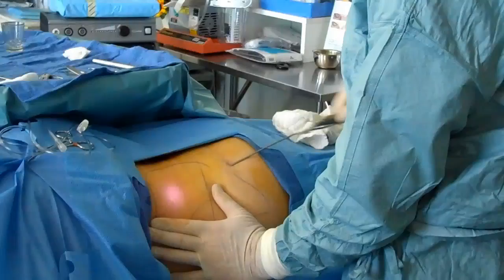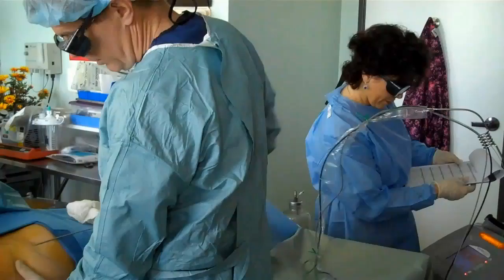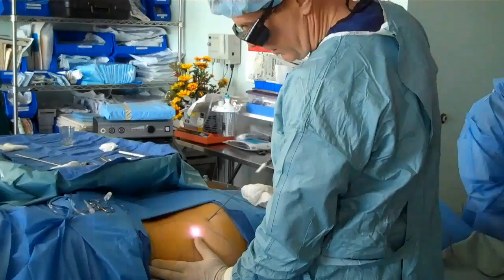This area that I'm treating is her left hip. It's almost like using a hot knife through butter — it just tends to melt right through the fat.